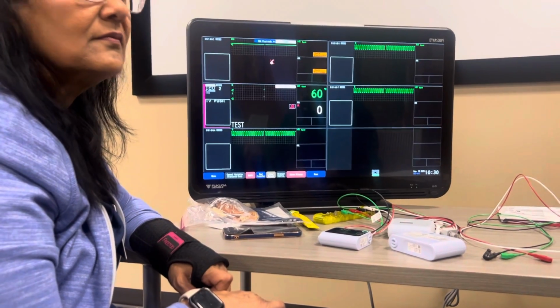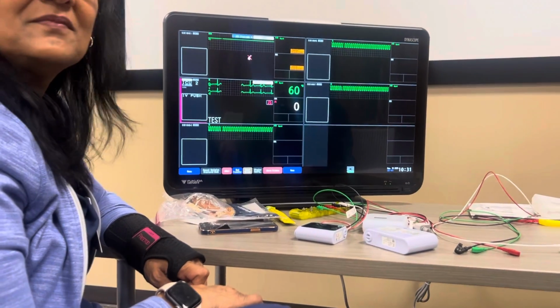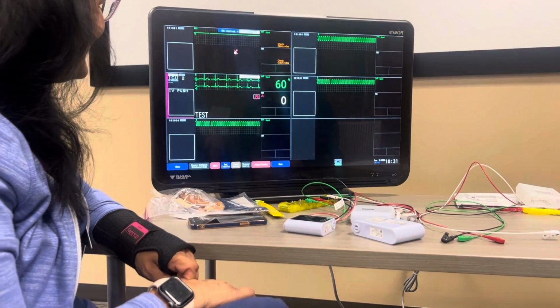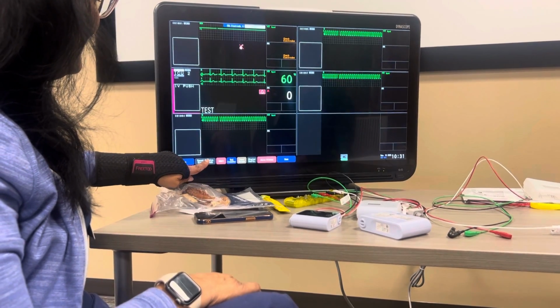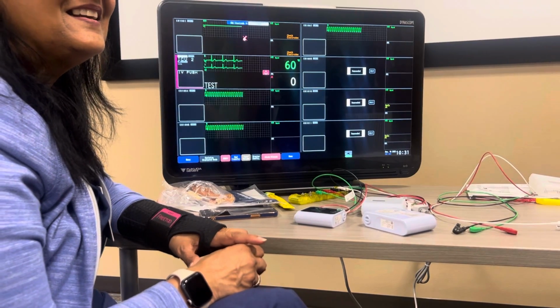That's really nice. You showed us the continuous before and it looked like it was gonna be a pain in the butt to select it before the walk, go back and select it after the walk, but with the time, you can just hit resume and get back to work. That's great. That's so helpful because of the amount of times that people come into the ICU and think our dog's in AFib, and it's actually just not even in here right now.